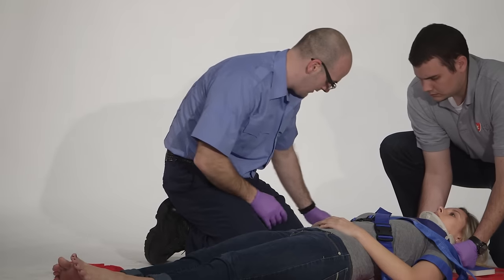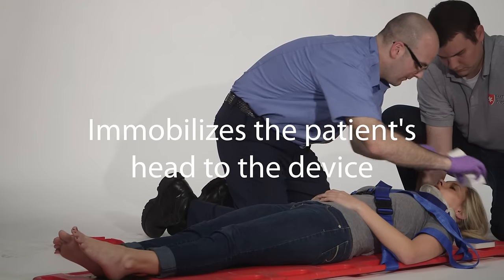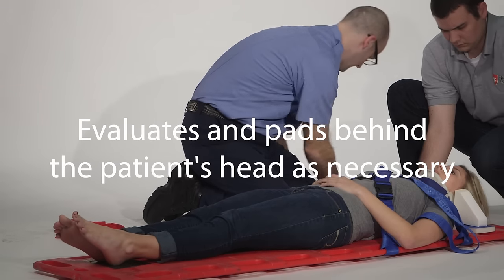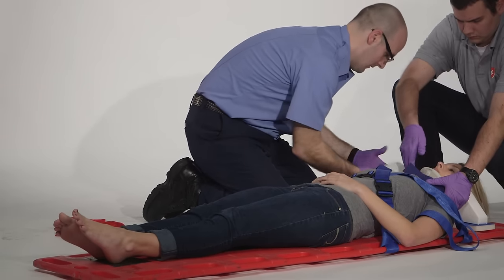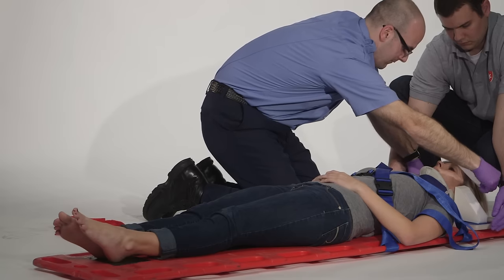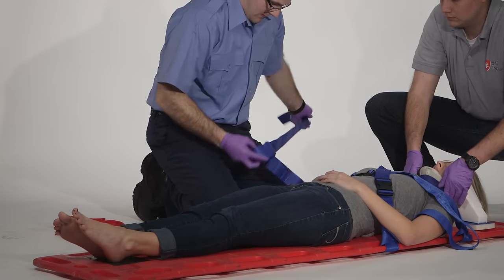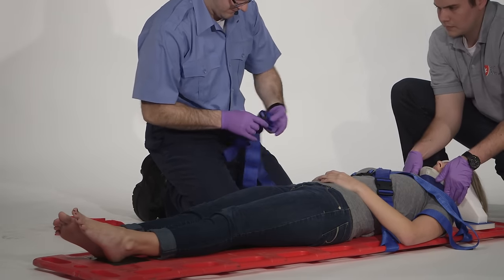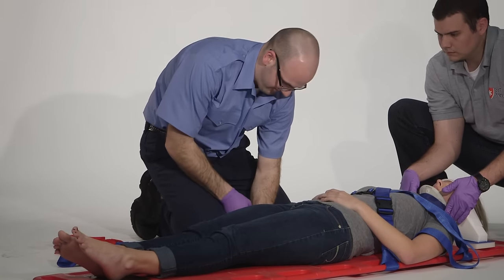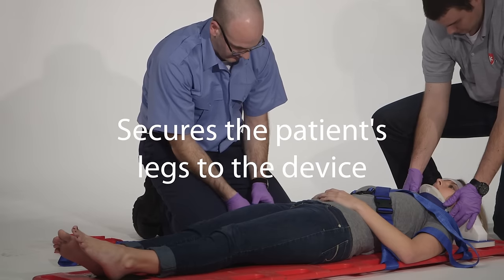Next I will secure the head. Patient's head is secured. Then move down the body to secure the legs and the feet.